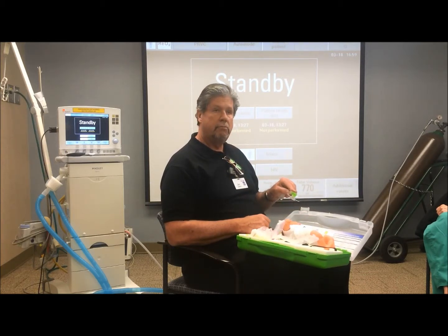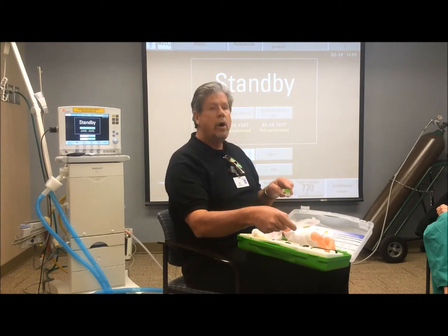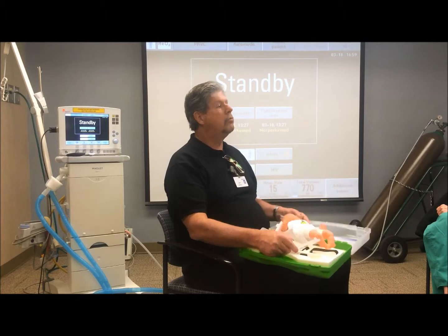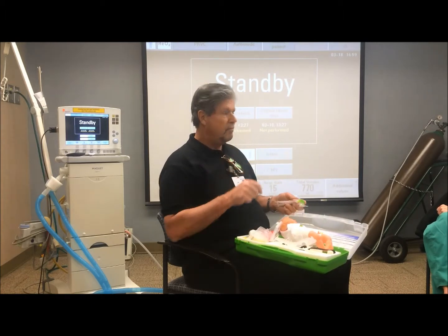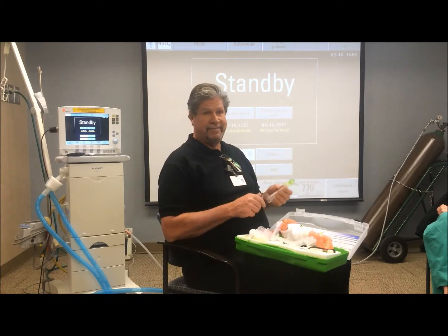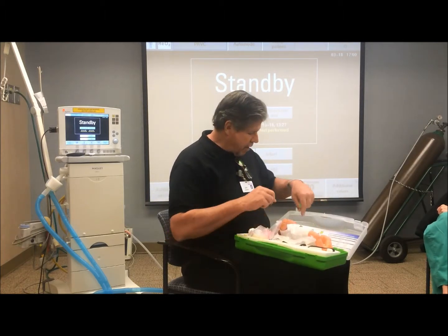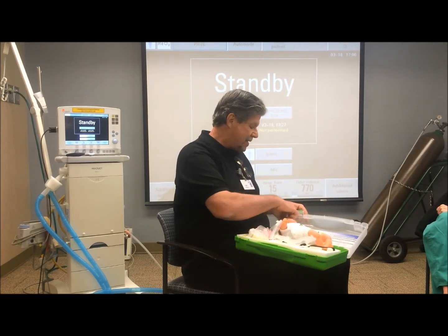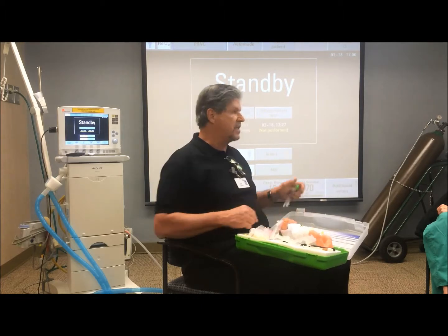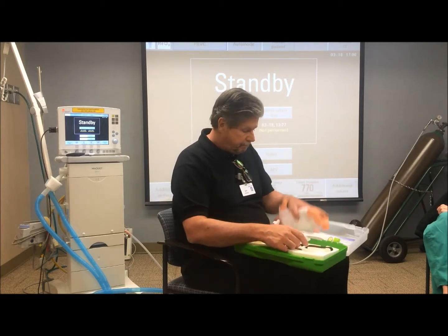Are we gonna have prongs? We don't have prongs, all we have are masks. Is that all we're going to have? I don't know. Right now, all we have is masks. Right now, all you have is masks. But there are 4 different sizes of masks, and there's 1, 2, 3, 4, 5, 6, 7 different sizes of prongs.